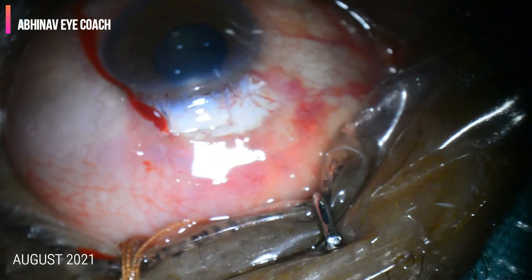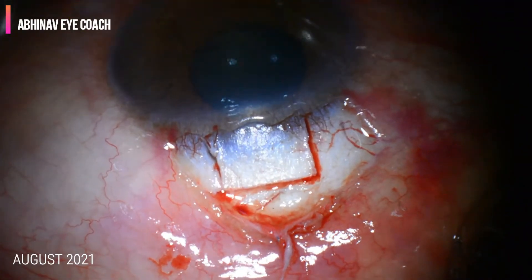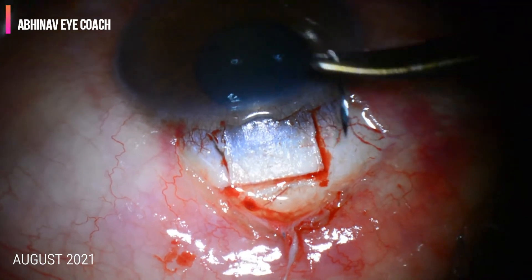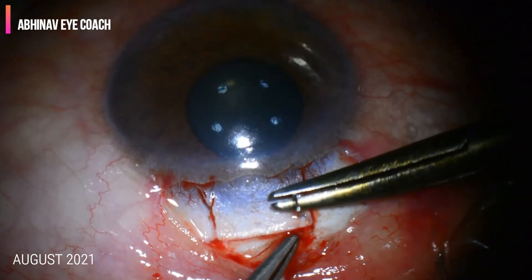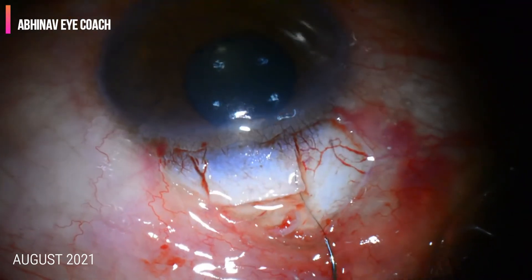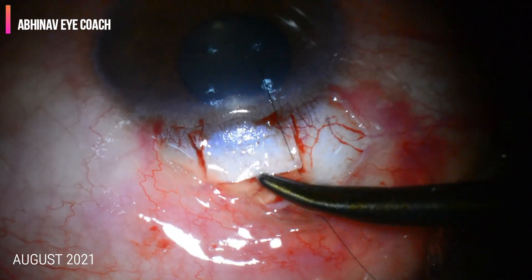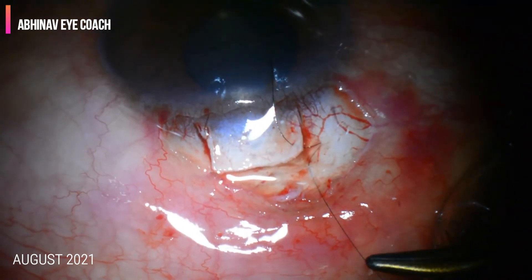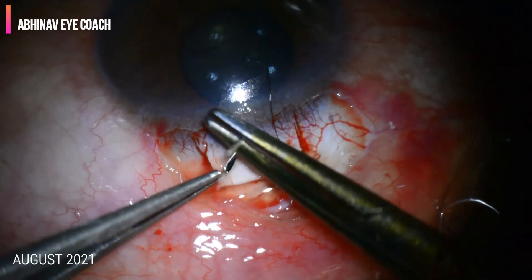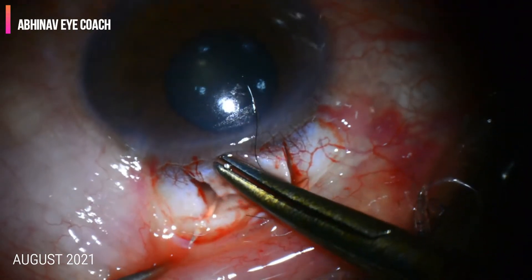After completing the scleral flap, we are going to make a sclerostomy or scleral block. I usually give two pre-placed sutures at the corners of the scleral flap so that it will be easier to close the anterior chamber after making the scleral block, because there are high chances of the anterior chamber shallowing after entering it.